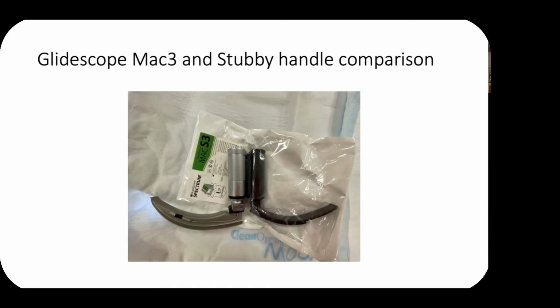Just in case you wondered, the GlideScope Mac blades have very similar handle lengths to the stubby-handled Macintosh laryngoscopes in maternity. The handles of our standard disposable Macintosh laryngoscopes are about 2 centimeters longer.